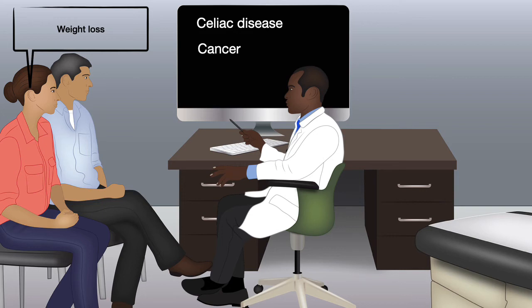And someone may be afraid of eating because of pain and weight loss, then you think about ulcers. So, EGD can be useful in the evaluation of patients with persistent heartburn, upper abdominal pain, difficulty swallowing, vomiting of blood, weight loss, or diarrhea.